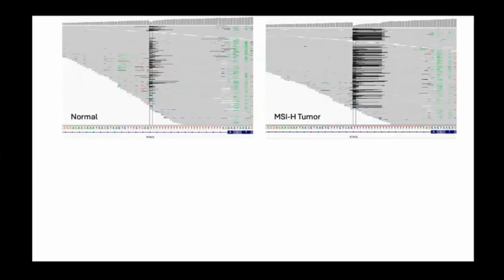Not surprisingly, when we're trying to assess microsatellite instability, we should be looking at microsatellites. This is going to be just a review of how our assay does this. We wrote our own code for this before some of these other modules were available, but I think it's instructive for just showing how you might want to look at these sequences.